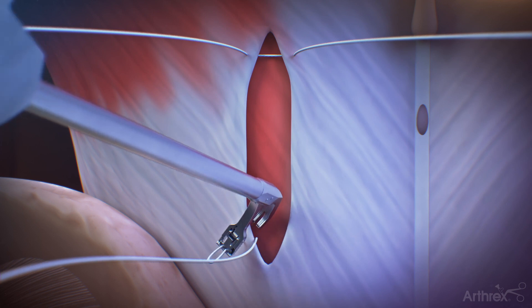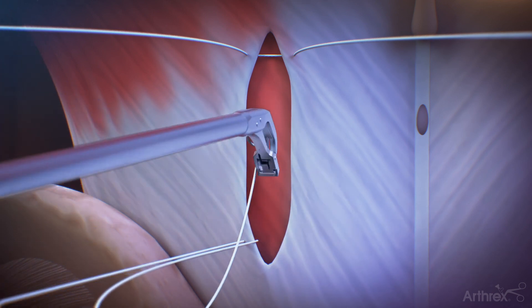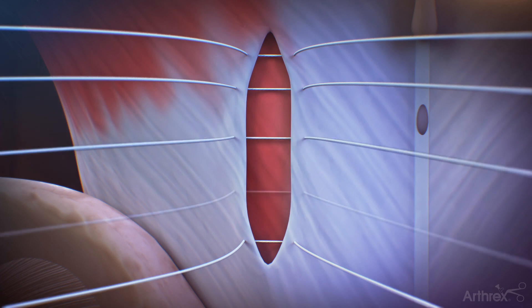Using a new suture, repeat the previous steps — first in the opposite corner of the fascia incision and then in the middle, passing as many times as needed until the surgeon feels the fascia can be adequately closed.